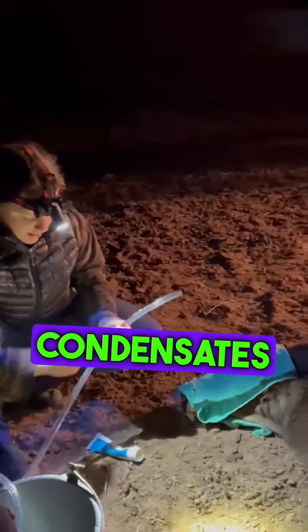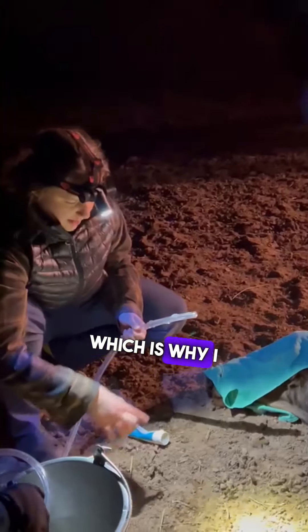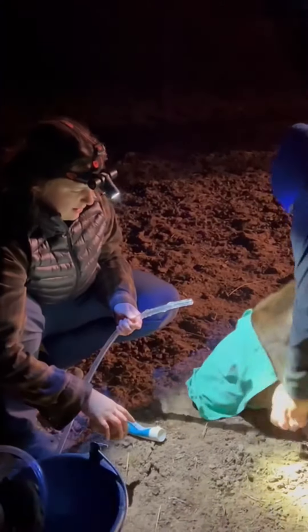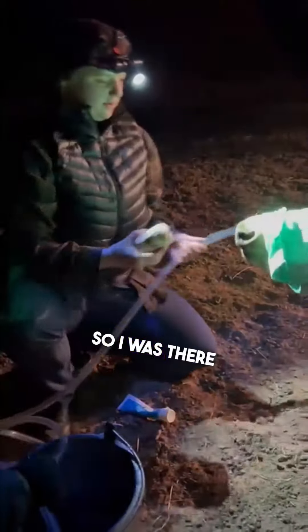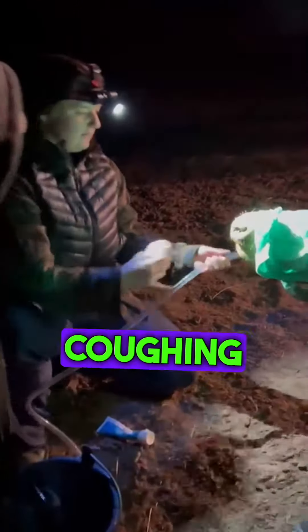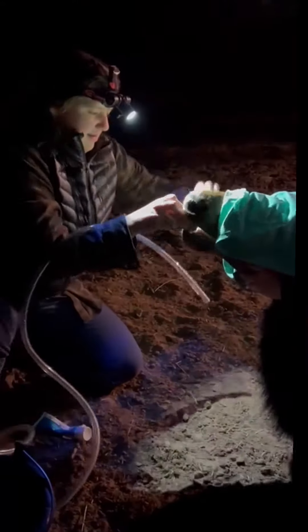When she breathes out, it condensates inside of it — and so I was definitely there once, which is why I pulled out. The brown fluid was her rumen fluid. I was there the first time, but she made that funny coughing sound that made me think absolutely not.